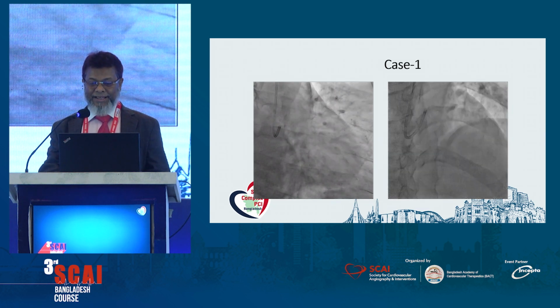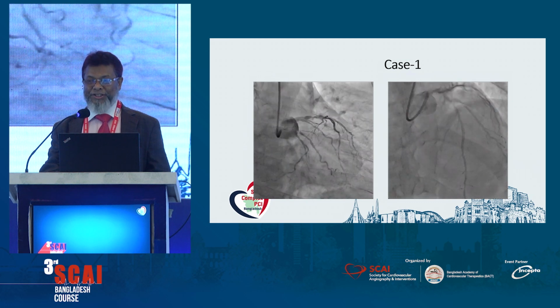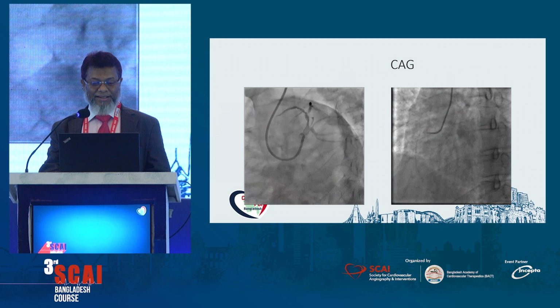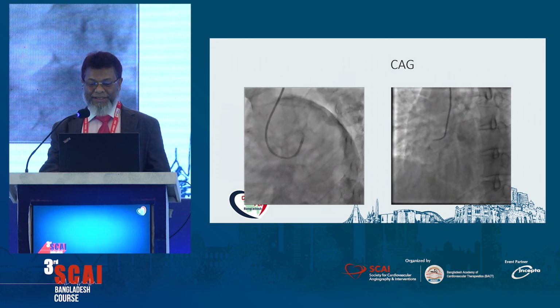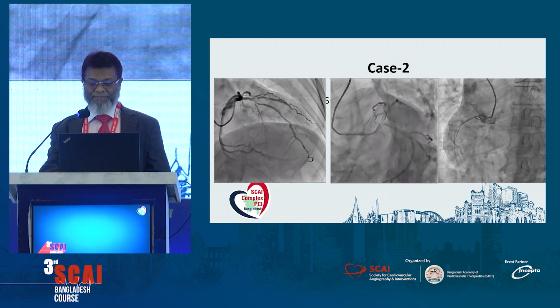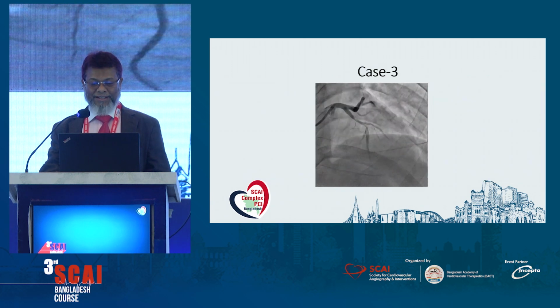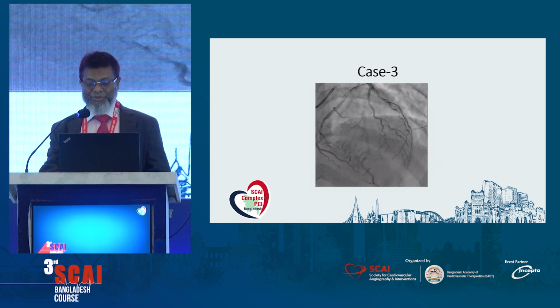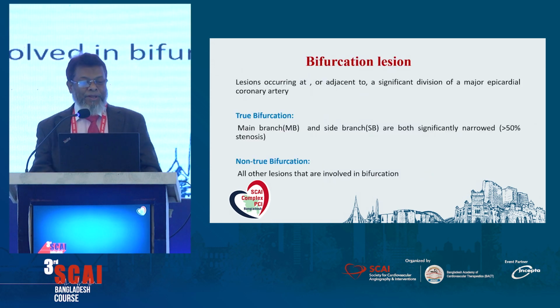This is a case of LAD diagonal bifurcation, ostial diagonal, as well as downstream disease. And this is another LAD diagonal bifurcation. And this is another LAD diagonal bifurcation involving the diagonal as well as downstream disease.